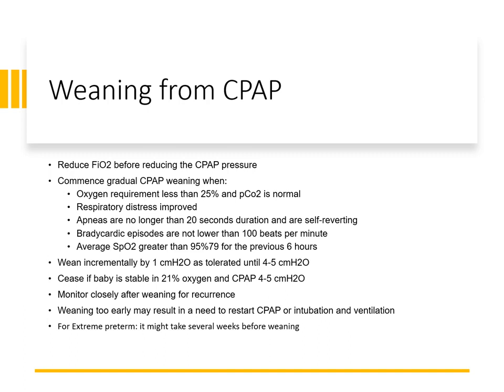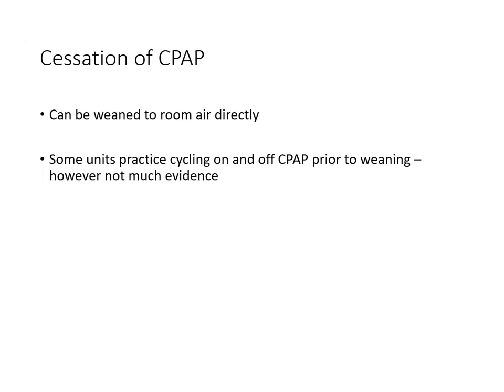Follow-up of weaning is essential, so babies can become distressed again and they can go back to CPAP, and we need to watch them carefully. So early weaning, which does not follow a protocol, might result in increased distress and thereby actually even necessitating intubations for that baby. So weaning has to be in a protocolized manner.